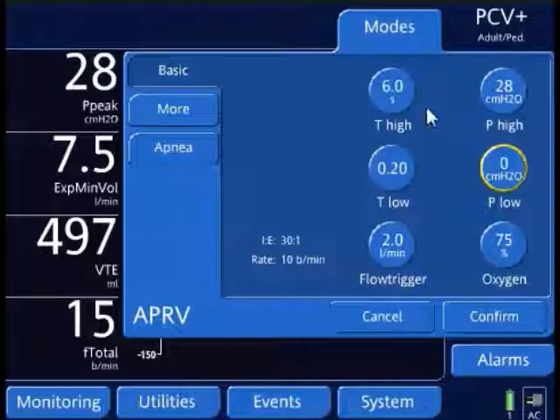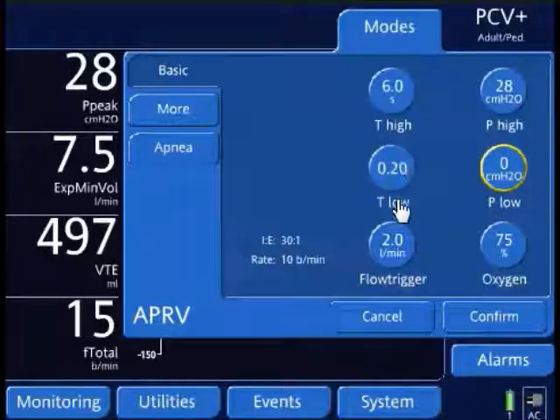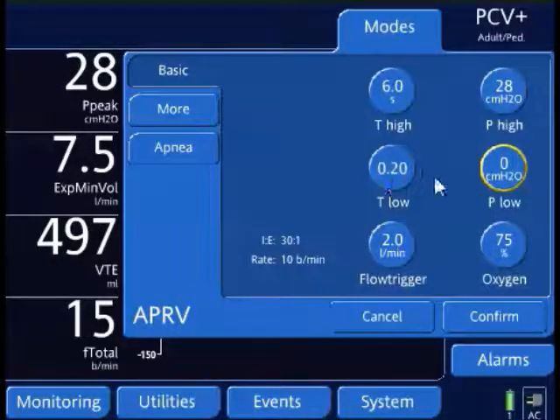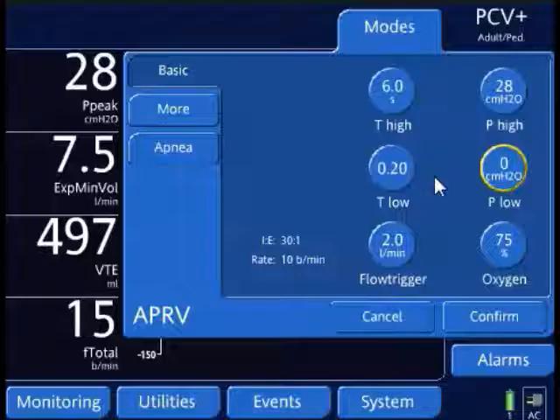T-High — an appropriate T-High setting for an adult patient is 6 seconds. And I'm going to set my T-Low based on my expiratory time constant.